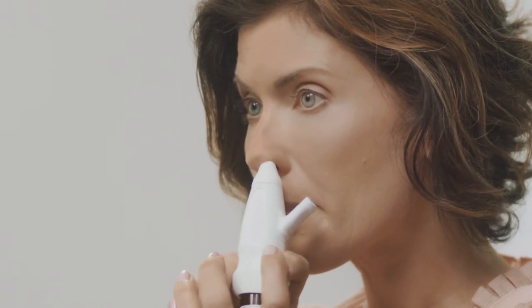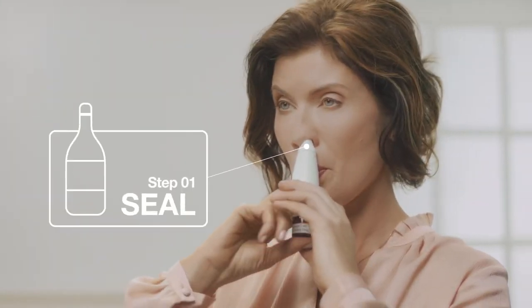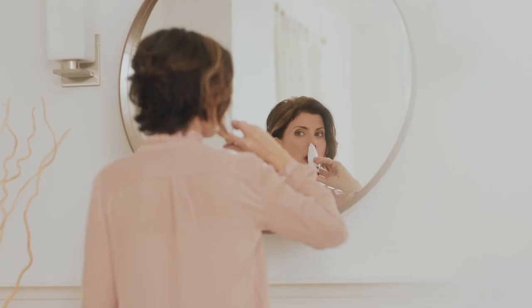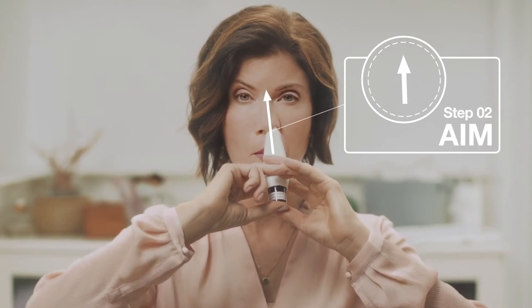Now you're ready. Step one: seal. Gently insert the nosepiece as far into your nose as is comfortable and the flexible mouthpiece into your mouth. It's okay to bend the flexible mouthpiece. It's important to make sure you get a good seal between the nosepiece and your nostril. Step two: aim. Aim the device upward between your eyes, which will help the medicine go high and deep into your nose. It may help to use a mirror for the first couple of times.